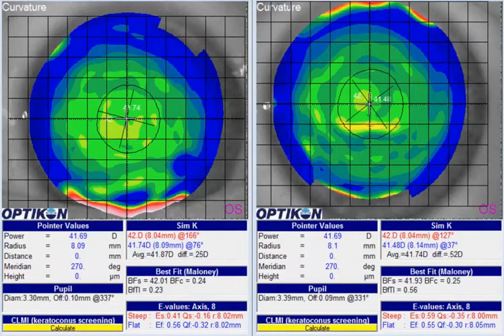This is a hyperopic orthokeratology case with a patient not getting full treatment and slightly reduced acuity. Looking at the posterior topography, we're seeing a little bit of change centrally and inferiorly, but not much else is going on.